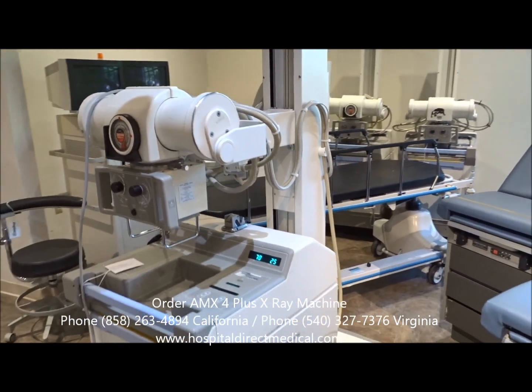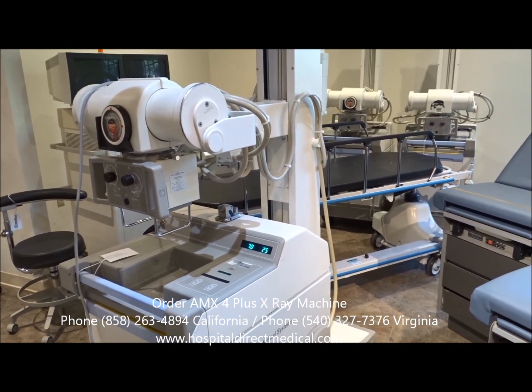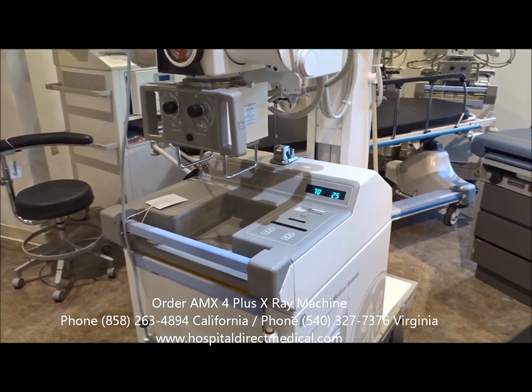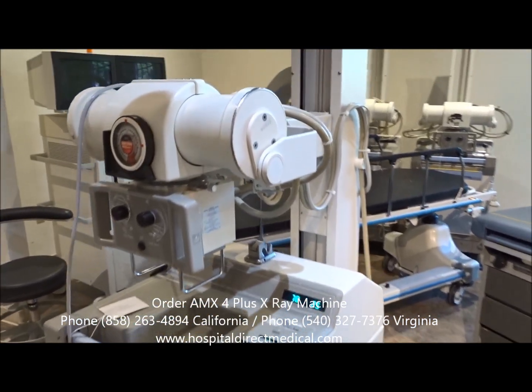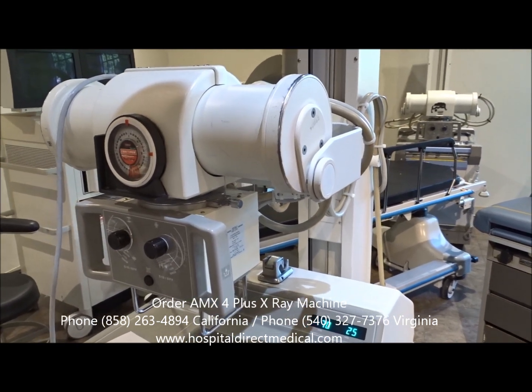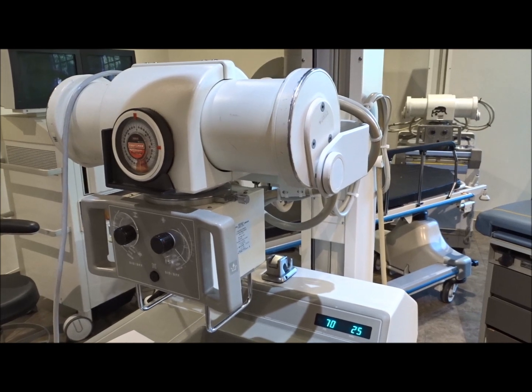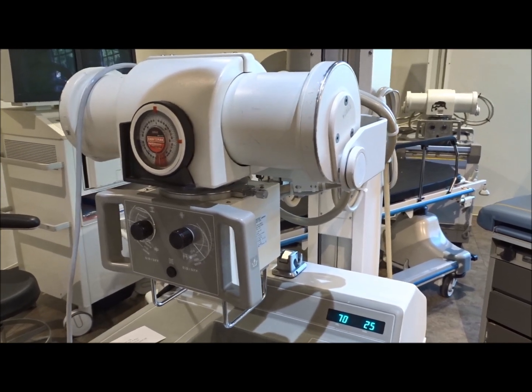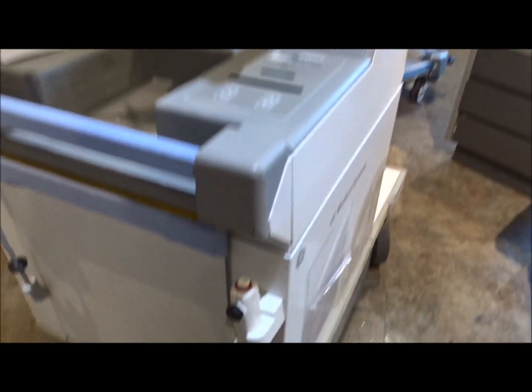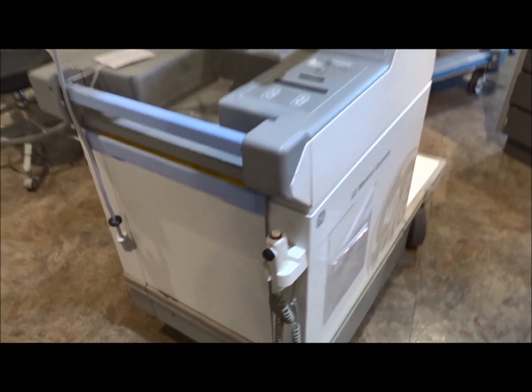We've got quite a few different AMX 4 Plus machines in stock right now. If you're looking for portable x-ray equipment including the GE AMX 4 Plus, give us a call for more information. These refurbished units will be biomed certified, patient ready, and ready to go into service. They are used in hospitals around the United States and internationally — very easy to use and a very popular portable x-ray made by GE.